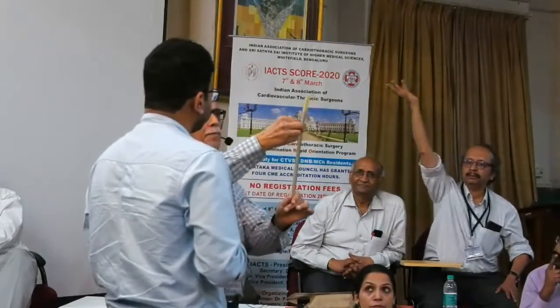The nerves start going up, come out from here, you are looking at the blood. Clamp or what? Why do you want to clamp it? Remove it and suck it.